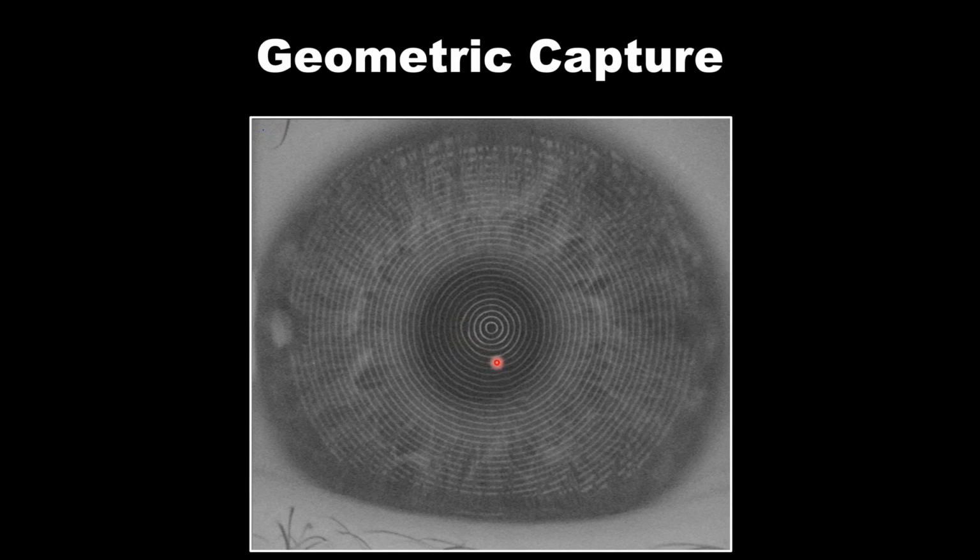That's the kind of thing you want to avoid. You want those rings to reflect parallel and even, as smooth as they can be. Now again, if I look at the periphery of those final rings, I'm pretty happy with the centration of this topography laterally. This is what you would call a much more geometrically centered topography as opposed to a visual axis capture.